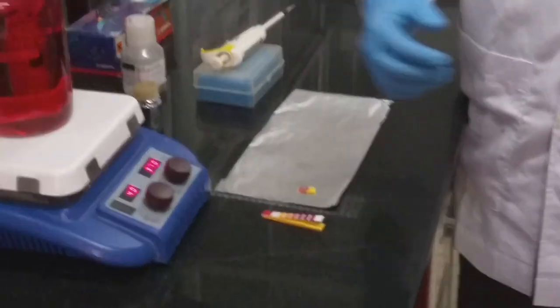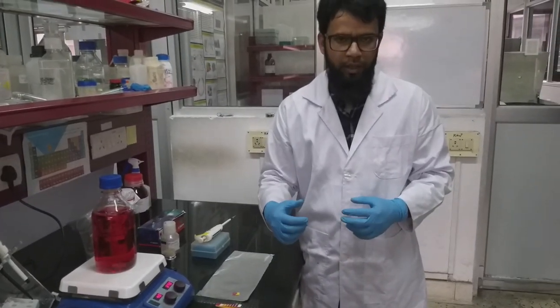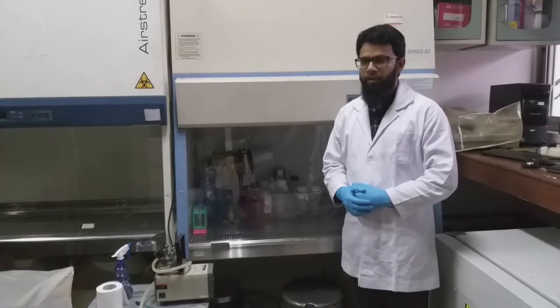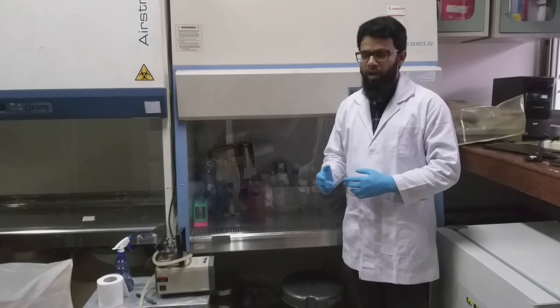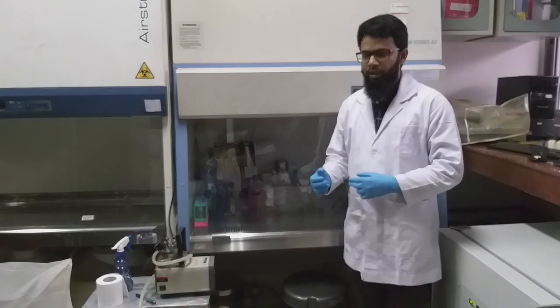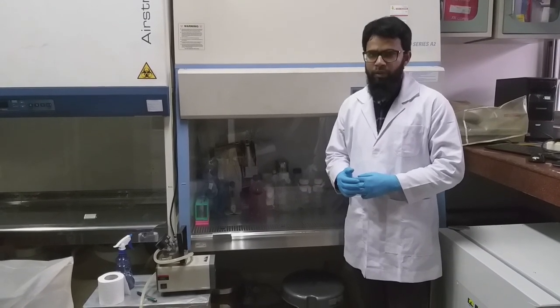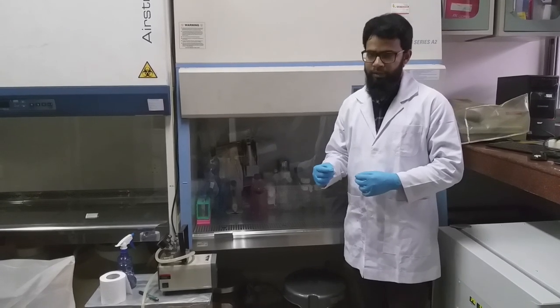After the media has been set, we now need to filter the media inside the biosafety cabinet as we have added the constituents in the non-aseptic condition. After the media components have been completely dissolved and the pH has been set, we now need to sterilize the media using membrane filter. For that purpose, we use class 2 biosafety cabinets which are used for handling mammalian cell cultures.